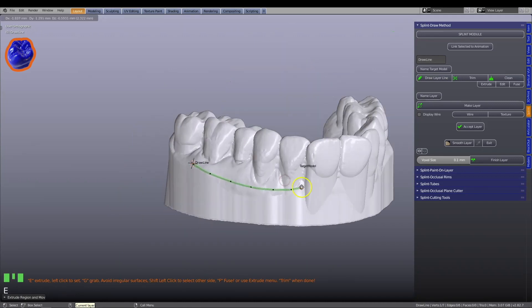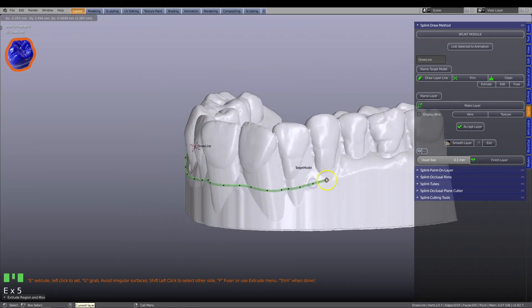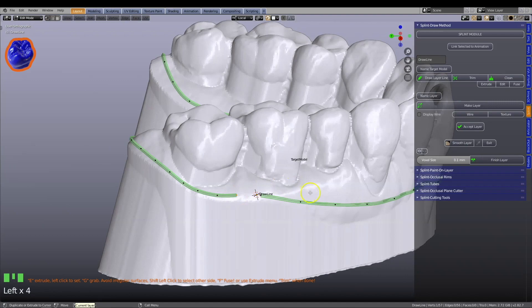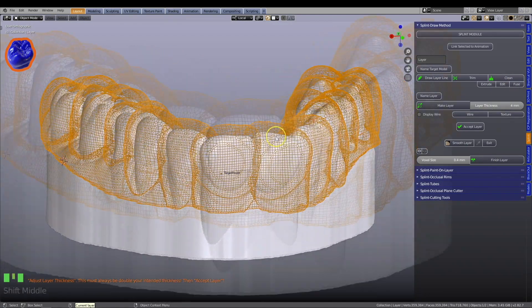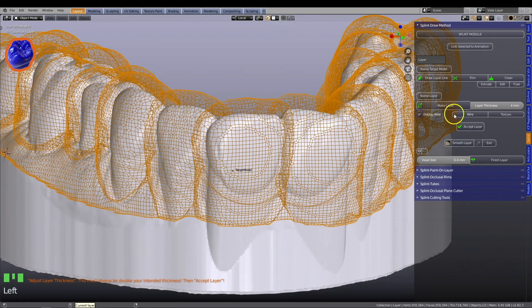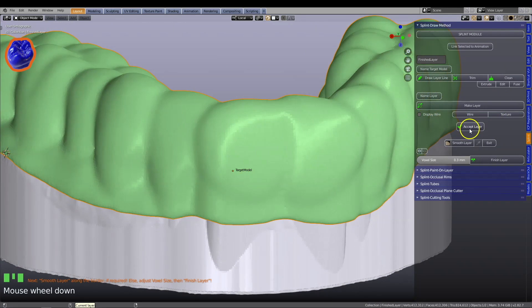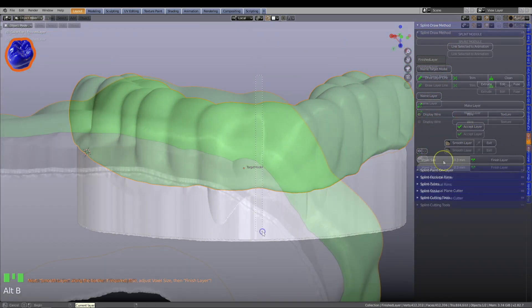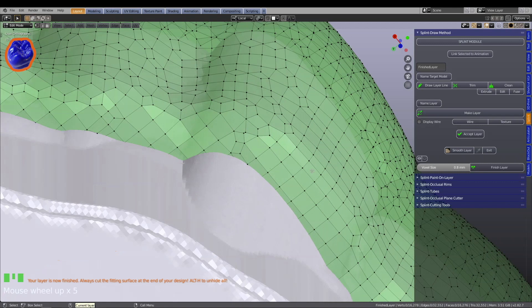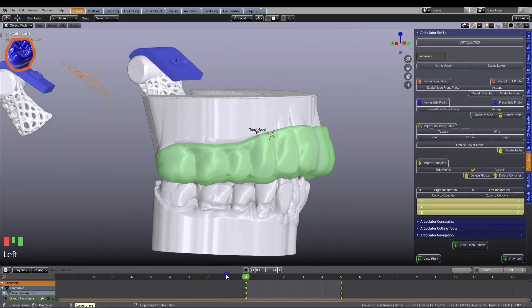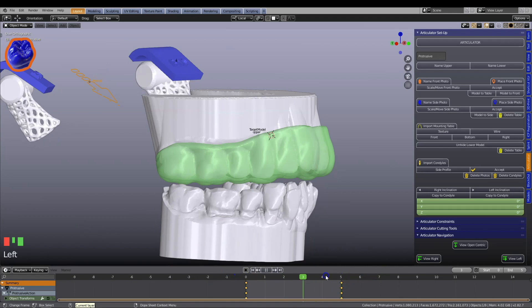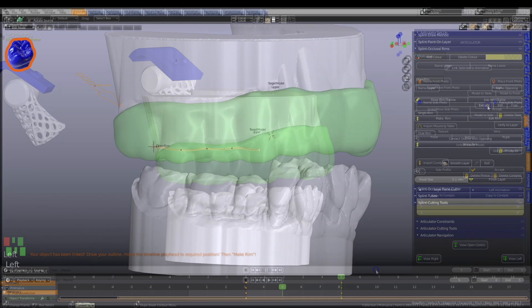You can either draw the outline of the splint, or you can use a unique paint-on-layer method. Learn how to keep a perfect mesh geometry while designing your splint, then use the articulator to cross-reference your work.